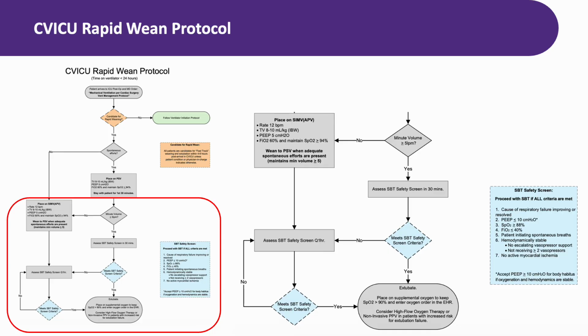In the cardiac surgery population, every hour of unnecessary ventilation increases the risk of complications, and waiting for a provider to come write an order and see the patient when the patient is clearly ready creates unnecessary bottleneck. This is a significant responsibility and a significant trust that has been placed in respiratory therapists on our team. It means your assessment skills and your adherence to the protocol criteria are critical.